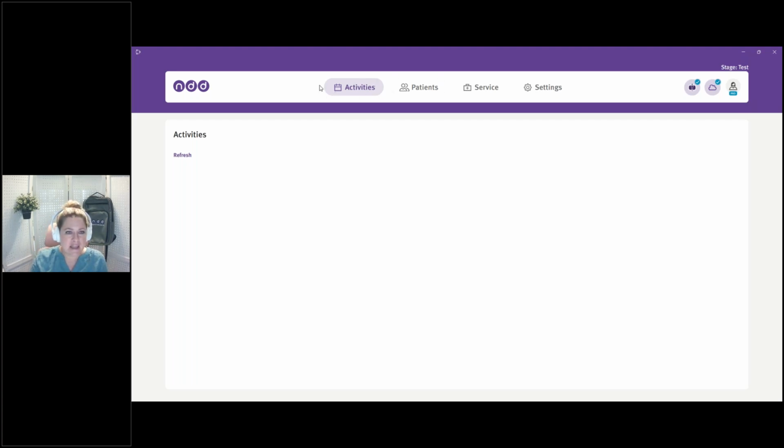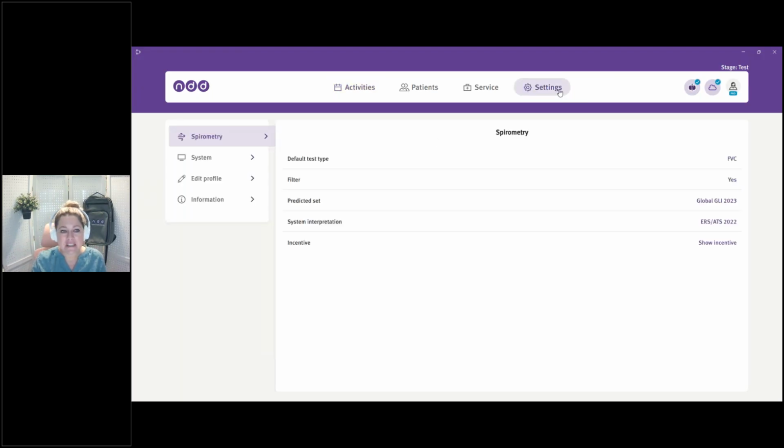The activities landing page here, we'll start here. You'll see that I don't have any activities pending. This activities page is really for those customers that are fully integrated with their EMR system, where orders are being placed in the EMR, sent to the EasyOne Connect software to show as pending tasks here on the activities page. And then as soon as those are completed in the software, those are synced back to the EMR. I'm going to hop over to the settings tab.